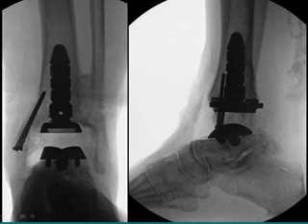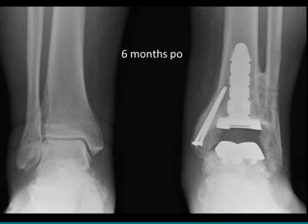This is the new Agility 2. And you'll see that it has the anterior prongs here in addition to the central stem. This gives reasonably good fixation to that area in spite of those talar cysts, which have been bone grafted with allograft in this particular case. And here, even though it's used relatively off-label, I've added a segment to the standard tibial stem. That is, instead of the standard 4, I've got 1, 2, 3, 4, 5. I've done that because of the weakness over here on the medial side, and this is all bone grafted with allograft. The construct's not looking too bad. So in spite of the large cyst in the medial malleolar region and the talus, we're able to come in and put a prosthesis in that has some possibility of capturing bone.